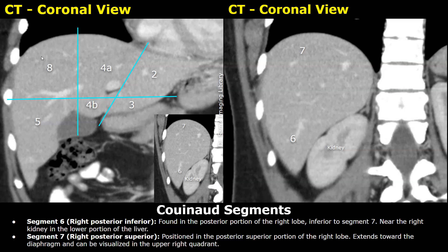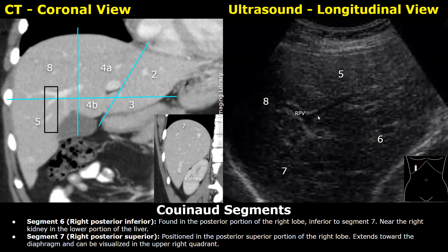In the coronal images, when you see the kidney and the spine, the upper half of the liver will be segment 7 and the lower half will be segment 6. When you get this longitudinal image of the liver and see the right portal vein and a U-shaped diaphragm, you can see segments 8 and 5 anteriorly and segments 7 and 6 posteriorly. Segment 7 is seen posterior to segment 8 and segment 6 is seen posterior to segment 5.